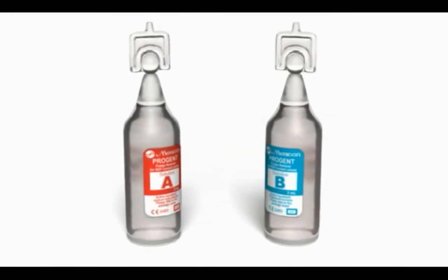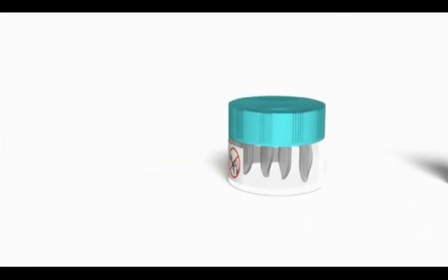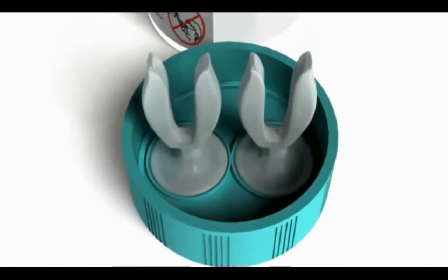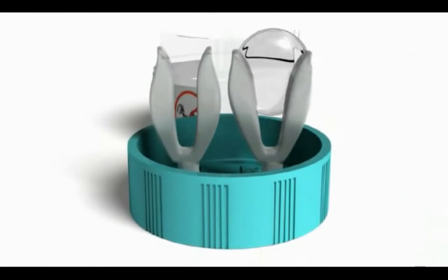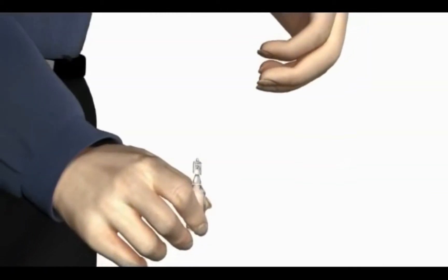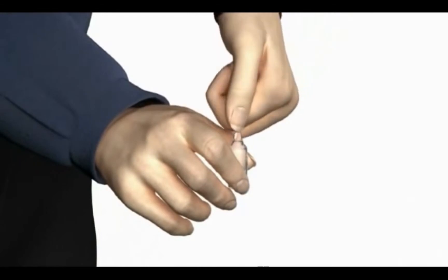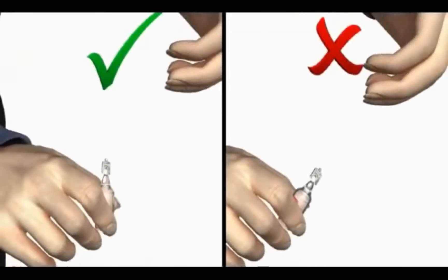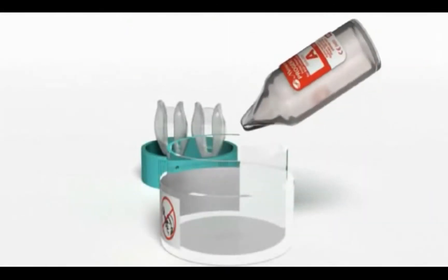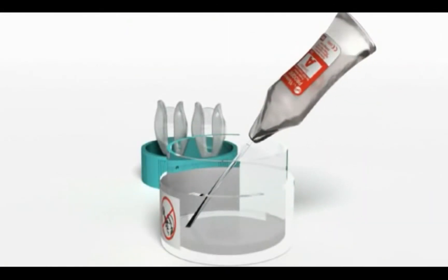Minicon ProGent is the mixture of two solutions. Gently place your lenses in the right and left-labeled ProGent lens holder. Open ProGent A by twisting the top. Hold upright to avoid spillage. Empty all the contents of ProGent A into the vial.